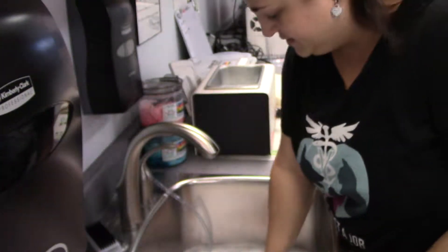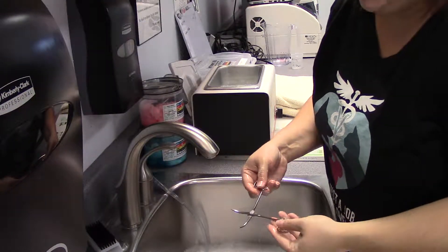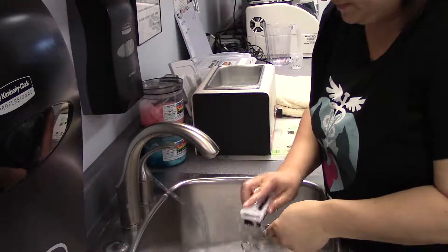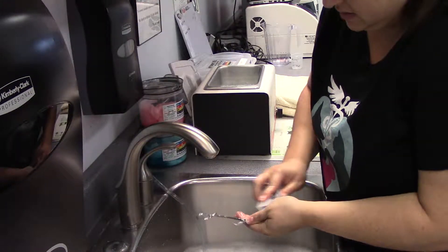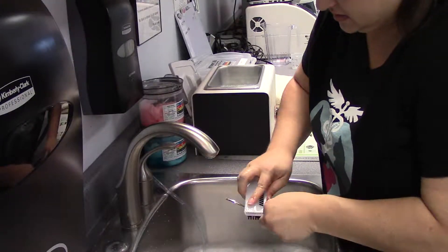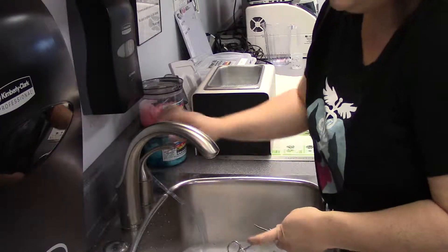For cleaning instruments, what we first do is we soak them in warm water and Alkinox, which is an instrument detergent, and then we scrub them with a soft-bristled brush. We scrub all the surfaces. And then we'll rinse.